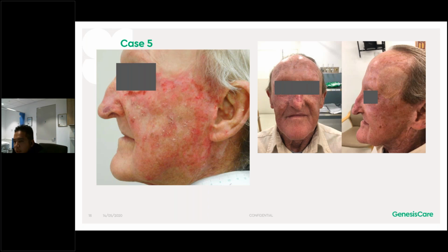He had a 5 weeks radiation treatment, and then now you see the picture on the right hand side of your screen. The difference between what it was like prior to radiation and what it is like now. He's a very happy gentleman now. He's still got most of his hair. Mind you, he probably noticed that he might have lost a few eyebrows, which is probably from the radiation treatment, which we'll be talking about in more detail at the end.